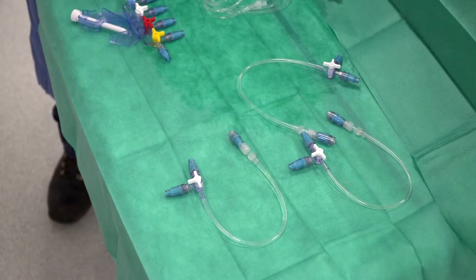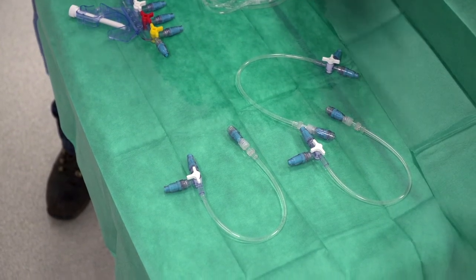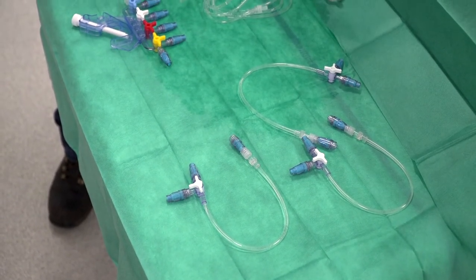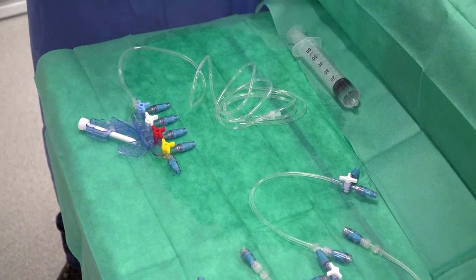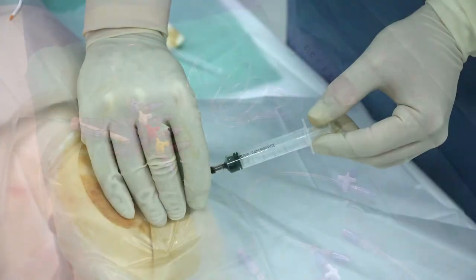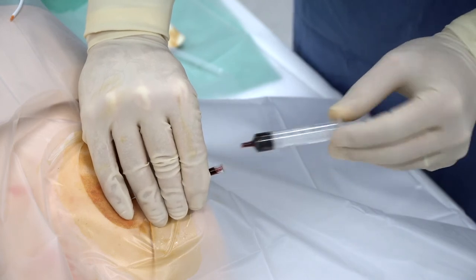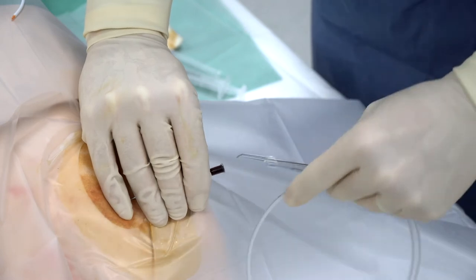Purge the infusion line through each connector by turning each stopcock sequentially. At the end of this step there are three extensions with three-way stopcock with purged connectors and a four-port manifold with purged connectors. Place the central venous catheter sterilely according to usual practice in the unit or hospital.